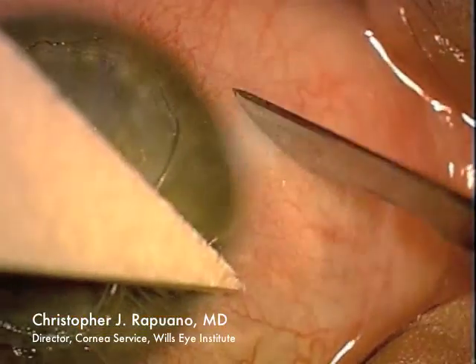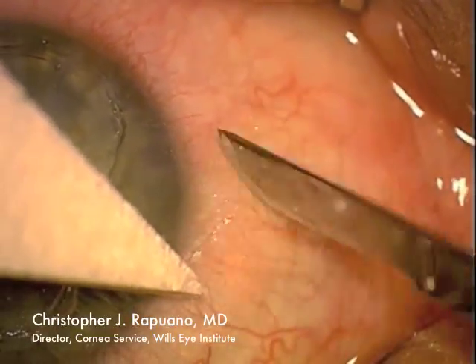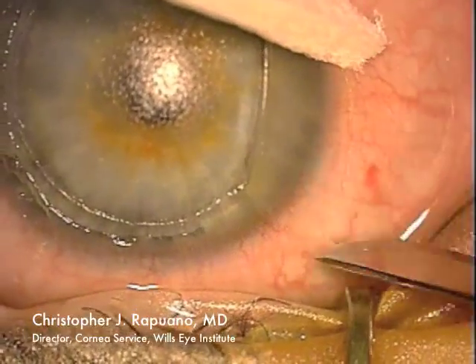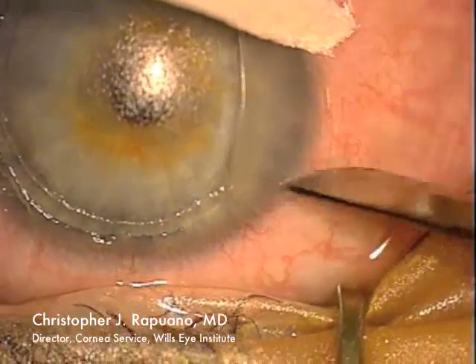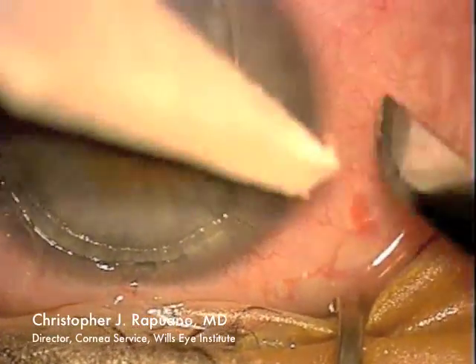On the underside of the flap edge, I need to be more careful so as not to damage the LASIK flap. However, I am very carefully but fairly aggressively trying to remove all epithelial cells from the underside of the flap. It's especially important to do it at the edge of the flap where the epithelial cells seem to be most adherent.